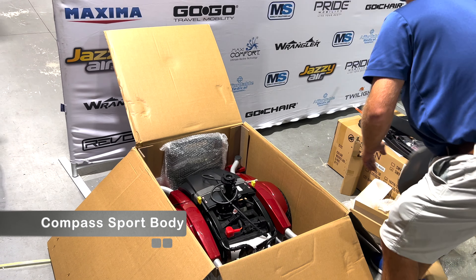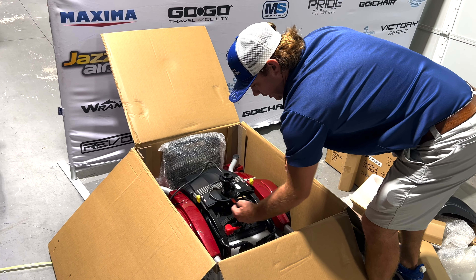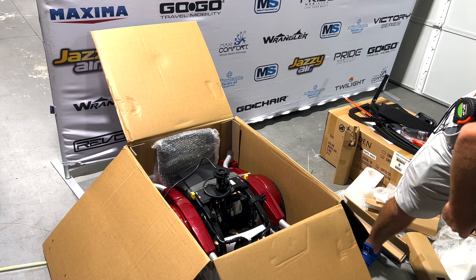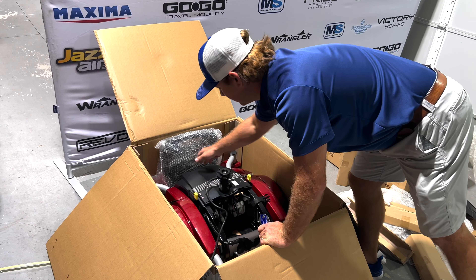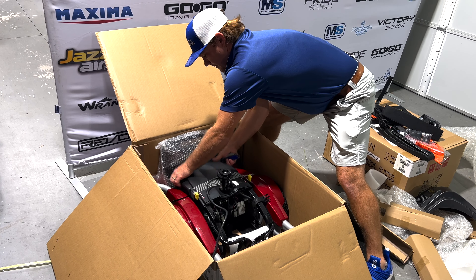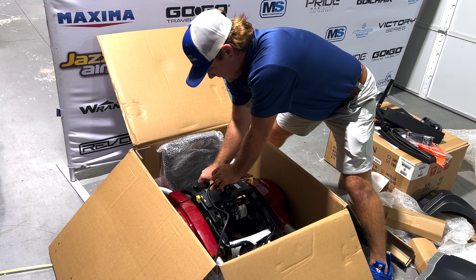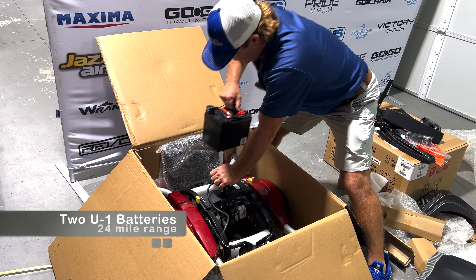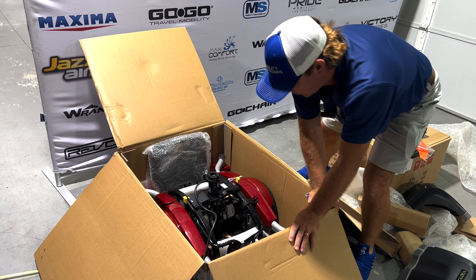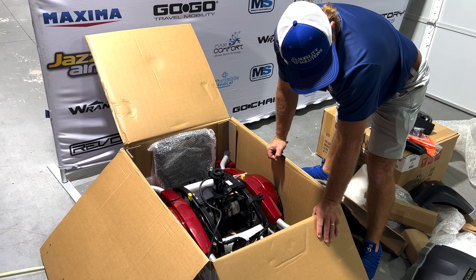If you're able to lift about 50, 60 pounds — again, this isn't one that disassembles. You can go ahead and take these batteries straight out to reduce the weight. Take the shroud off at the beginning, the front, or you can slot it right out. Two U1 batteries, and we have lithium phosphate batteries available if you do want a little bit more distance. These should get you plenty of mileage — you can get up to 23 or 24 miles with those batteries.